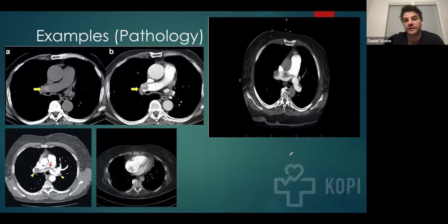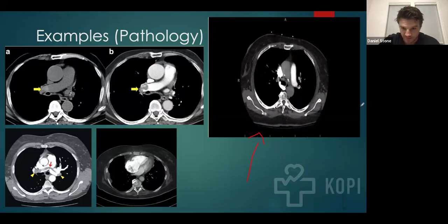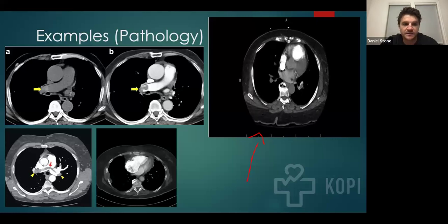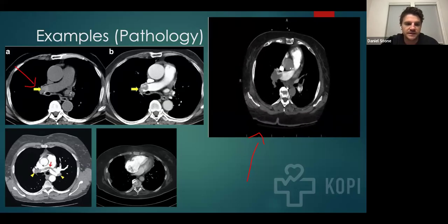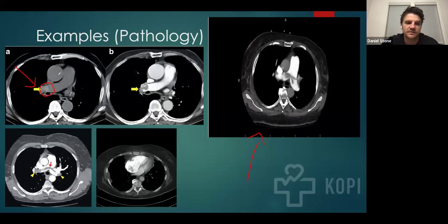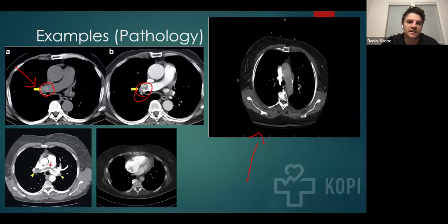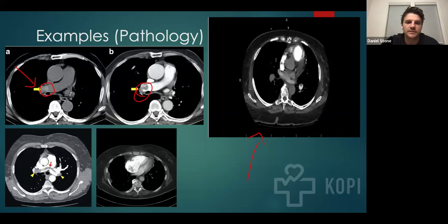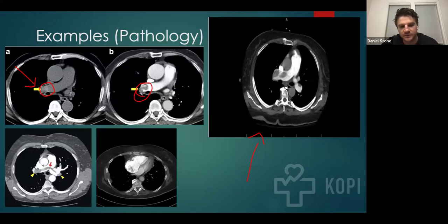Moving on to arterial and vascular phenomena. This GIF up here is a good example of a pulmonary embolism. Here in the top left, you can see what a PE looks like without contrast. It's very, very rare that you would otherwise see it without contrast, but under the circumstance, you can pause the image. It's much more subtle. When you add contrast, though, it becomes much more illuminated and much more obvious, and it basically shows that there's a filling defect within the actual pulmonary artery.